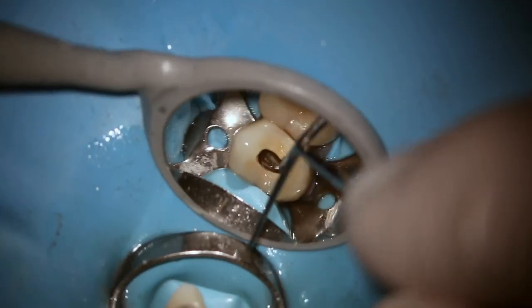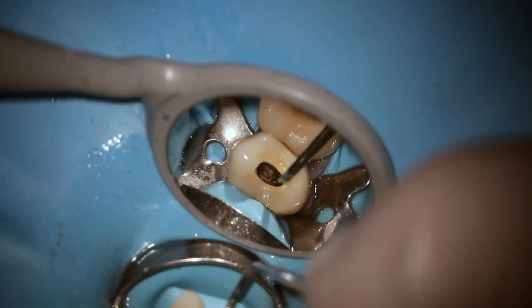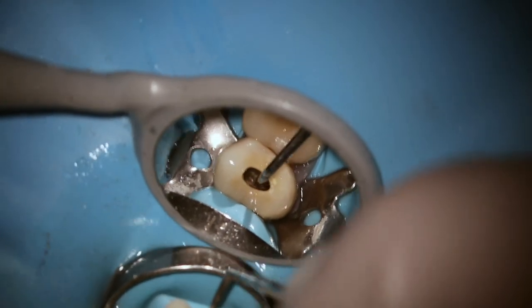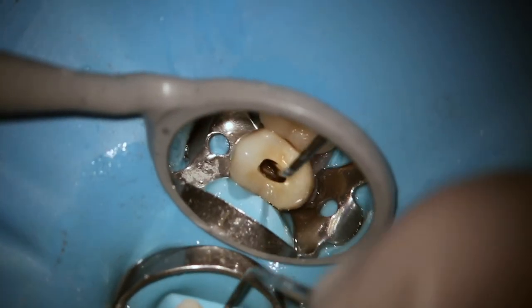You're painting in a buccal-palatal direction. Then your assistant is going to rinse and dry — you want it really dry — and then you inspect with your IndoExplorer. Look for a stick.